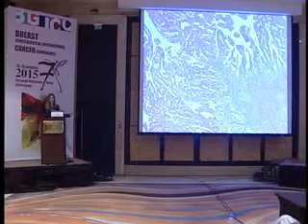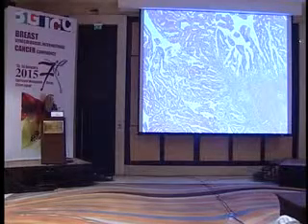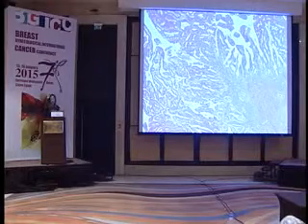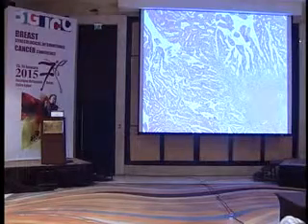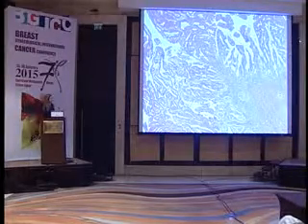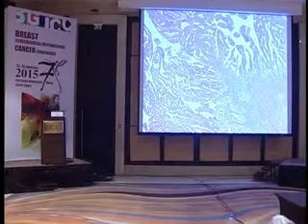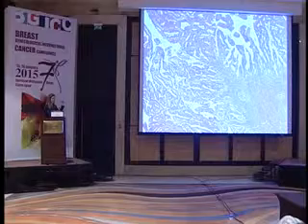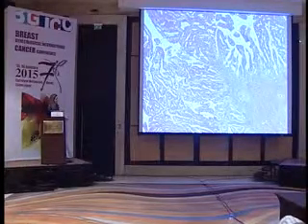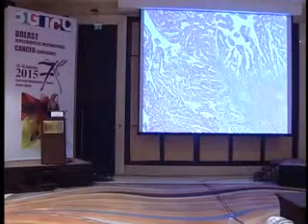You agree this is invasive, right? No question about it. And I have these, they are in the stroma. This is an exophytic lesion. Most of the time in the cervical adenocarcinoma, it's exophytic, papillary exophytic. But would I measure it from here down? Would I measure it from here down? Or would I measure it from here down? In the book, they tell you the closest AIS gland to the deepest gland, invasive gland. So it will be only from here to here.